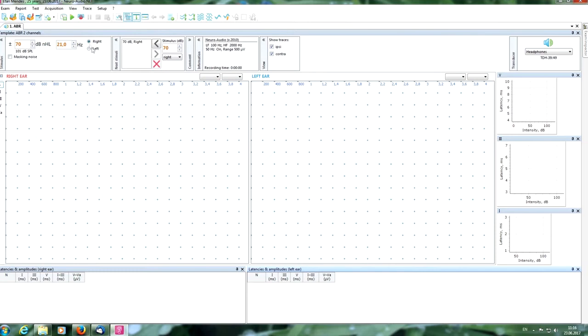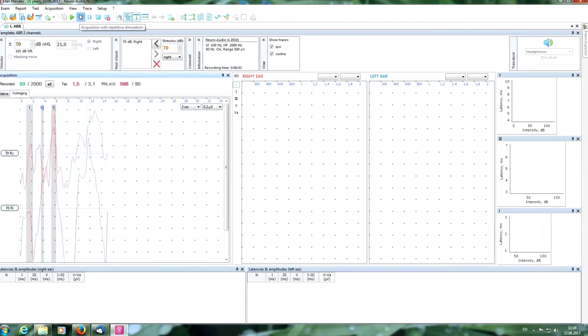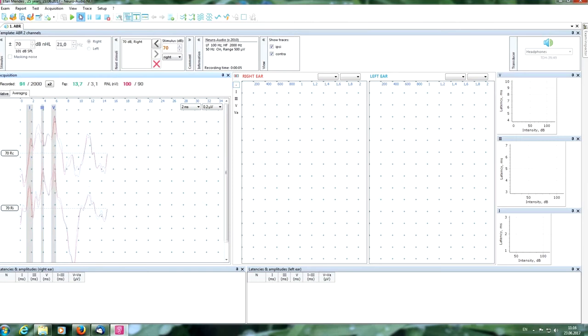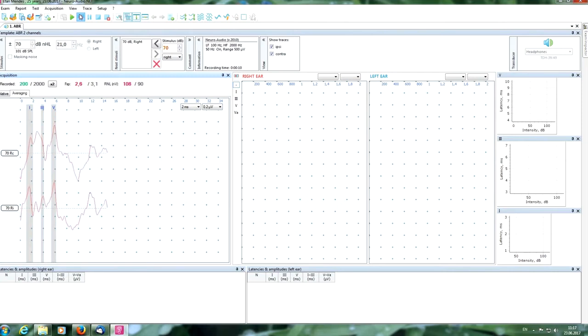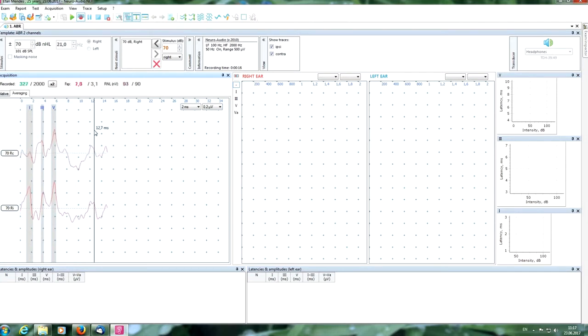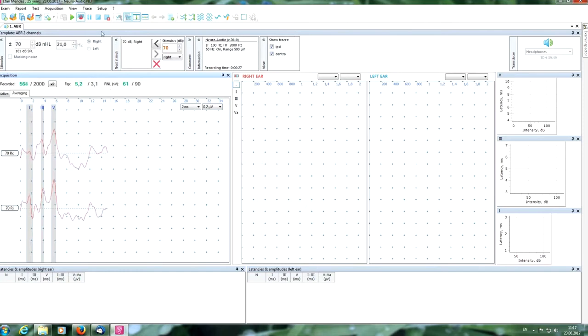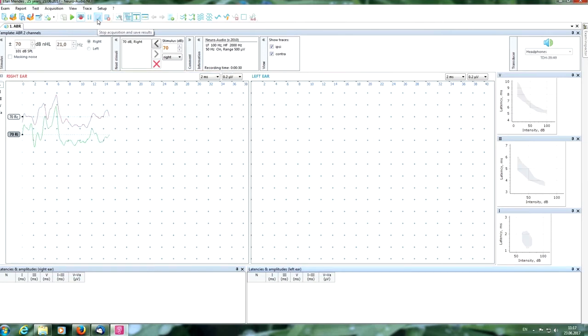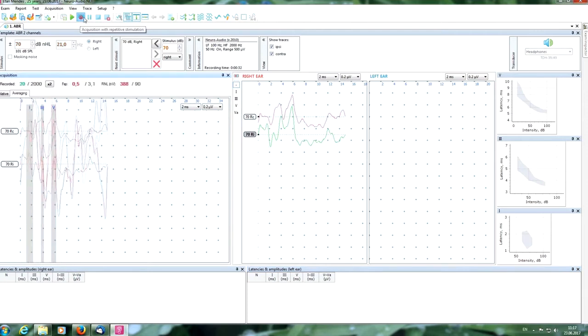Now we choose the side of stimulation and start the acquisition. Now you can see the stimulation and averaging process. Also you can see the grey bands of normal values for latencies of main peaks. Here you can see statistical parameters which allows us to estimate if we get the reliable response. We can stop the acquisition if we have a good response now.